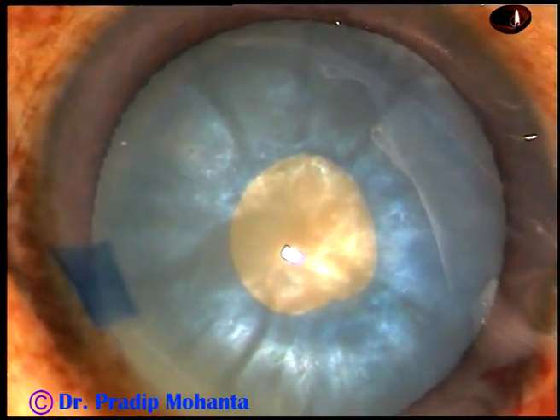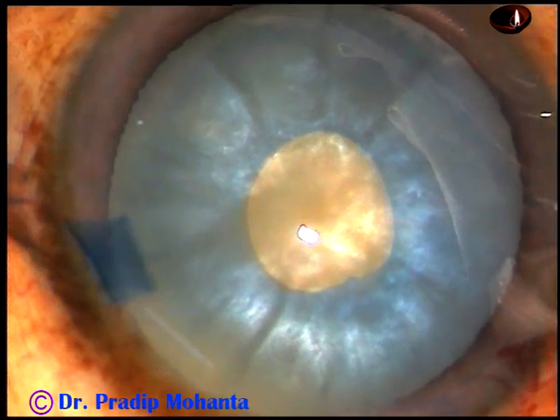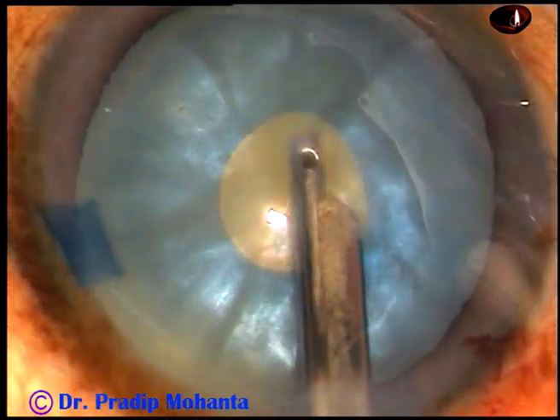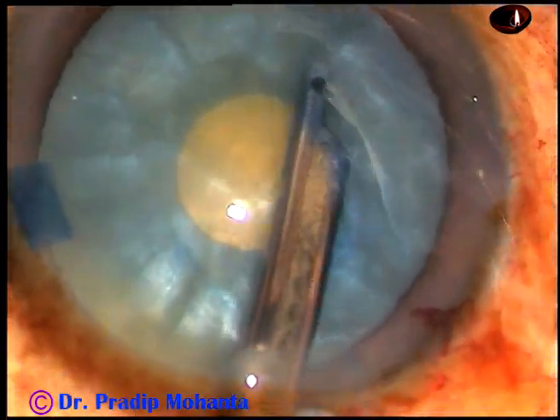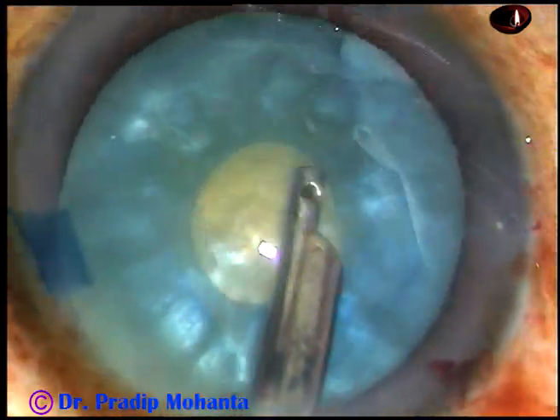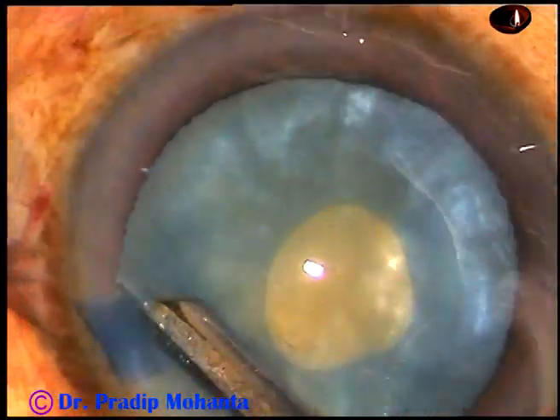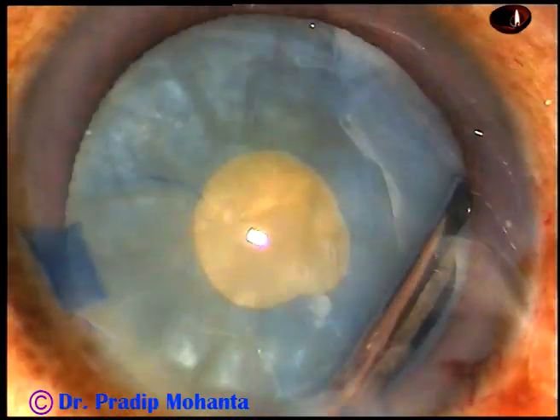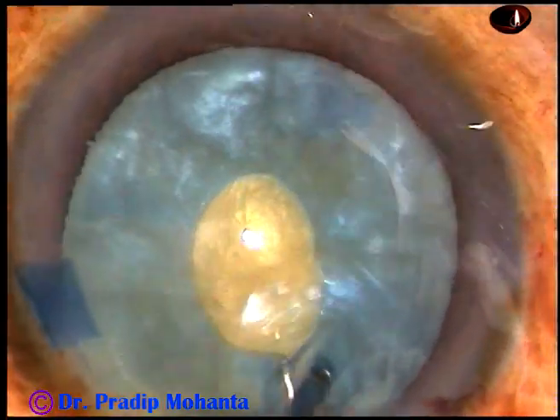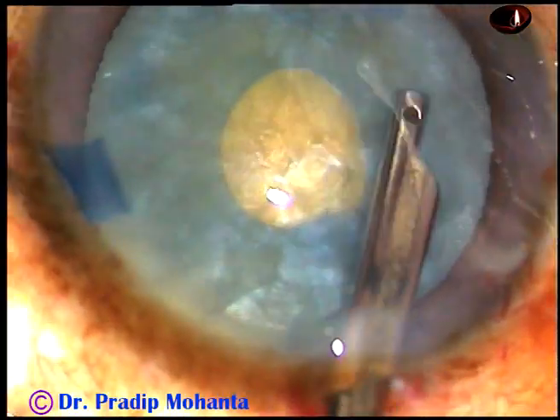This opening is used to aspirate some cortical lens matter to reduce the intralenticular pressure. If you remove some cortical lens matter through this mini-rhexis, the intralenticular pressure gets reduced drastically.